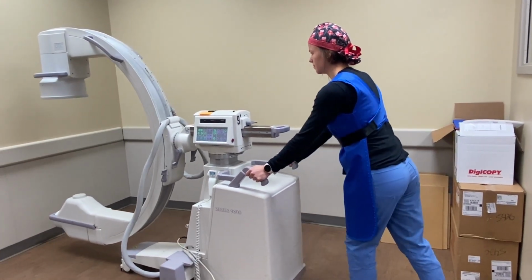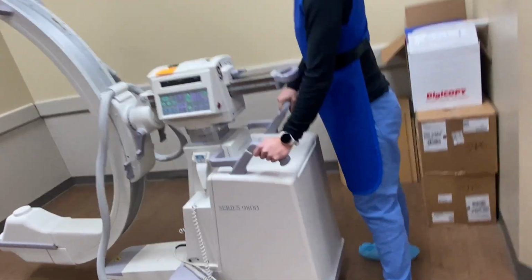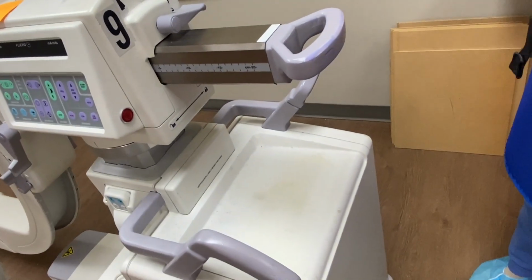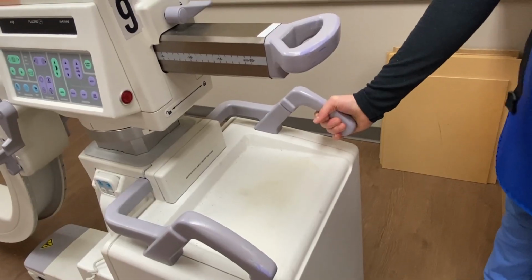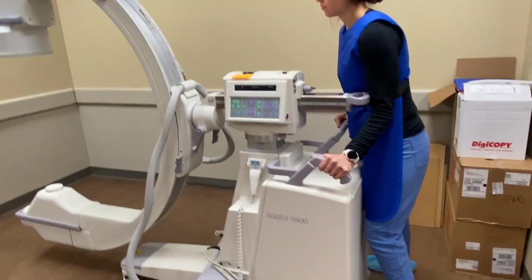The steering handle is used to direct the entire C-arm to move in and out and side to side. If you pull the steering handle to 90 degrees, it is able to move the C-arm side to side from head to toe. If the steering handle is straight on, it is able to move in and out from under the patient.